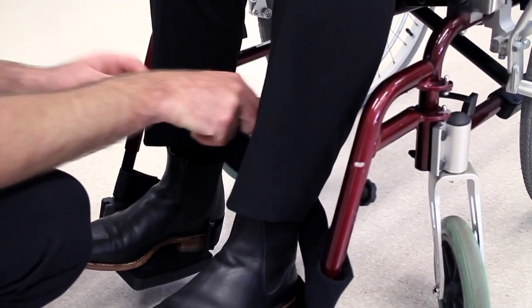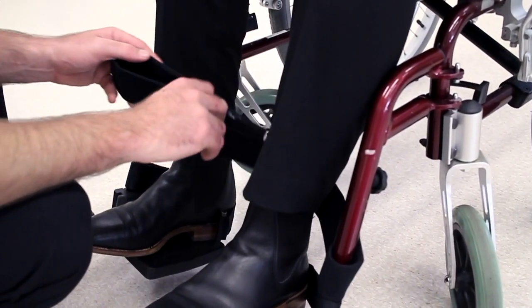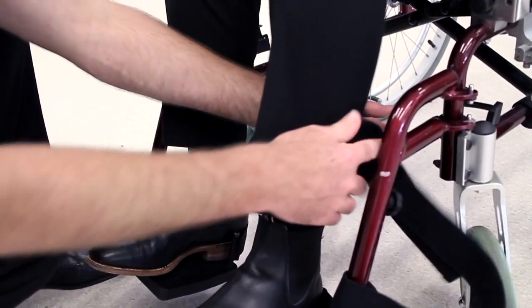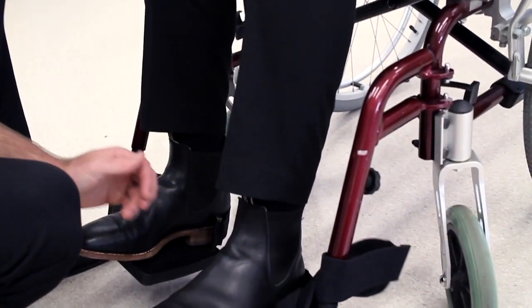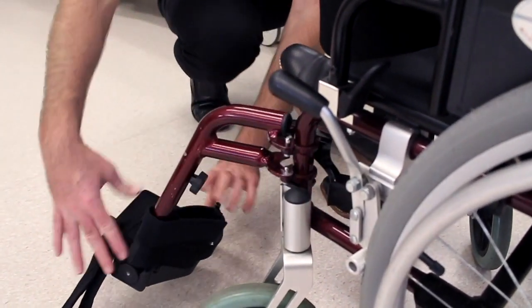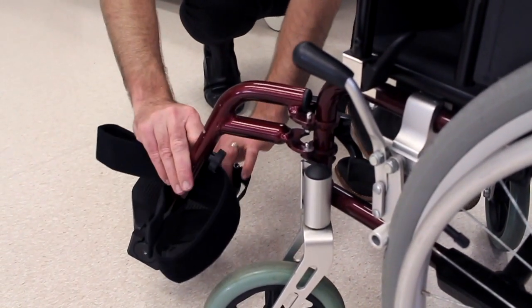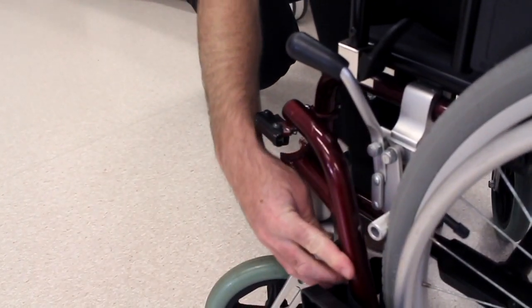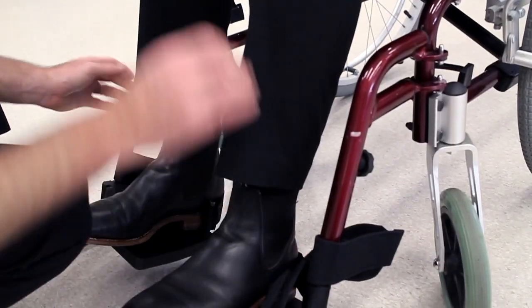Here we can demonstrate a one-by-one physical assist transfer from the wheelchair to the bed. The first step would be to remove the calf strap from the wheelchair if the wheelchair does have a calf strap. Then we adjust the wheelchair by removing the foot plates out to the side, making sure we swing them away before we flip up the footrest.